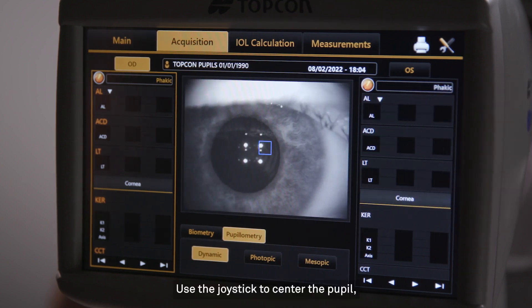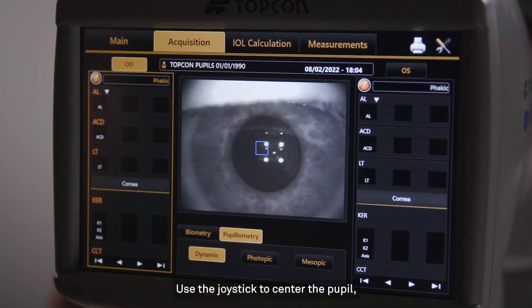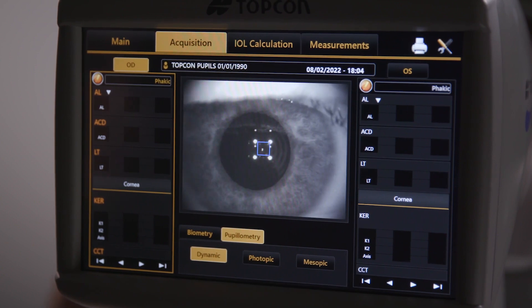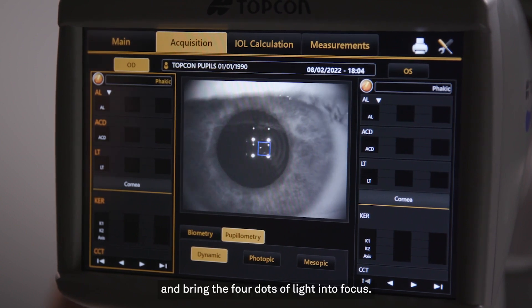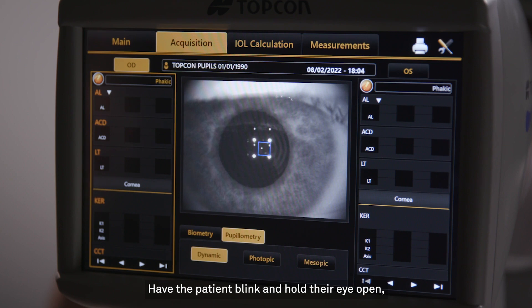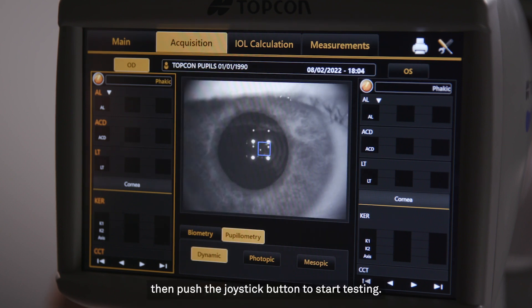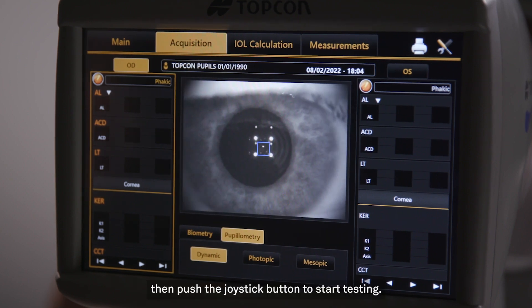Use the joystick to center the pupil and bring the four dots of light into focus. Have the patient blink and hold their eye open, then push the joystick button to start testing.